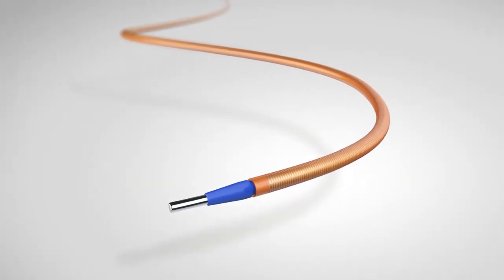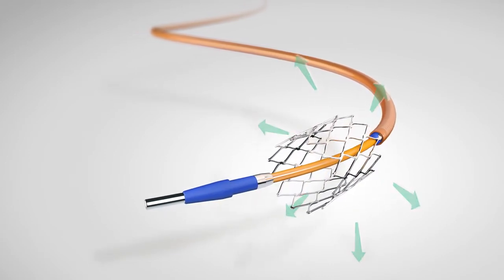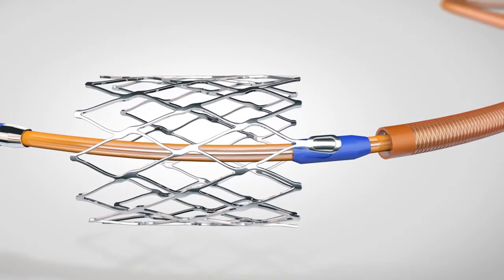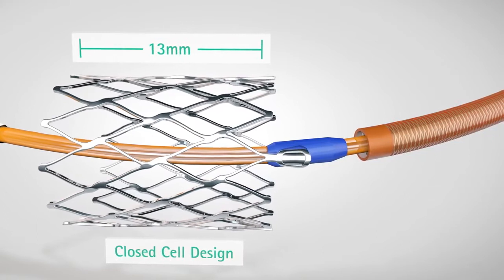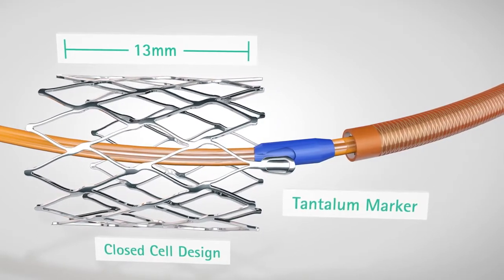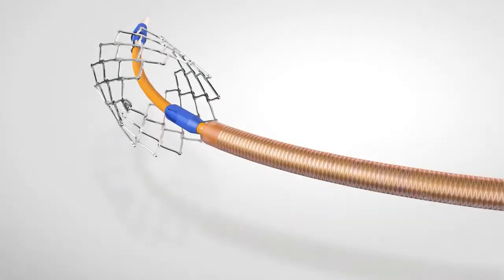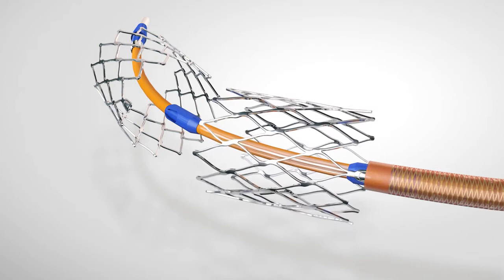Each self-expanding nitinol stent has a high radial force. The 13mm long stents have a closed cell design with tantalum markers on the proximal ends of the stents. The tantalum markers also help to prevent stent jumping.